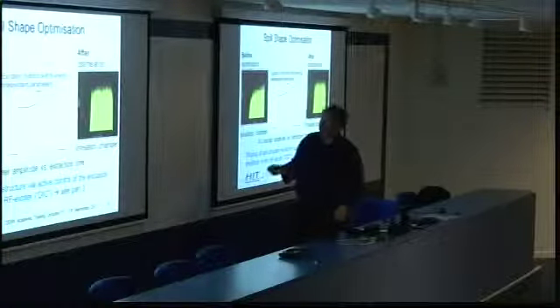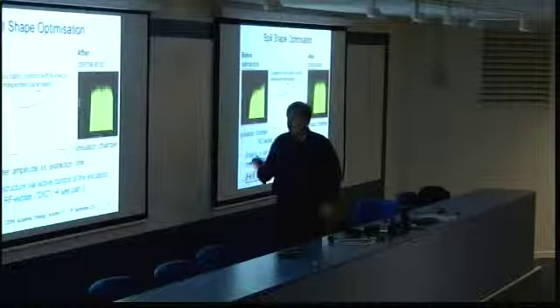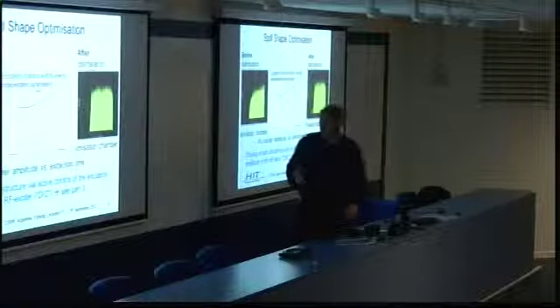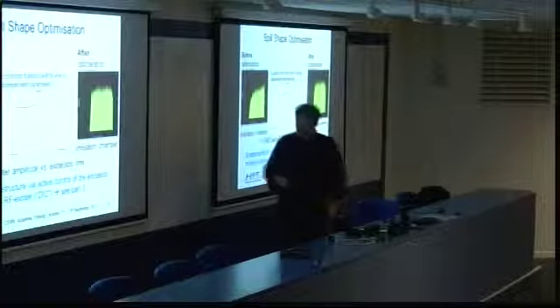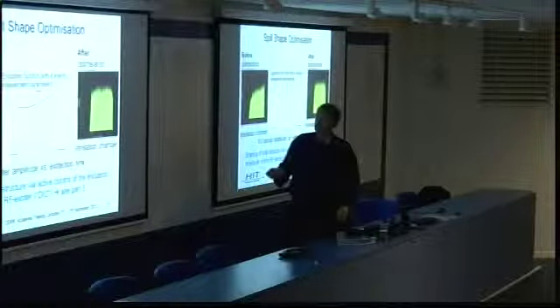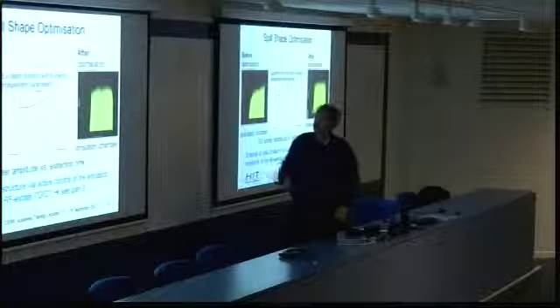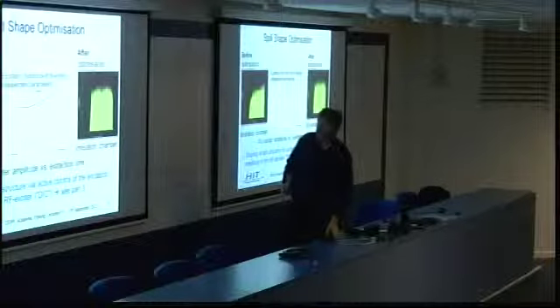But nevertheless, this is a shape we work with. I will tell you what we're doing to make that better for the future and to adapt that tomorrow. This is a concept which is called dynamic intensity control. So we will go from forward driven values to a real control loop, but I will report on that tomorrow.